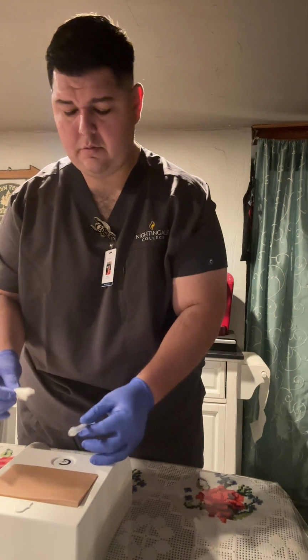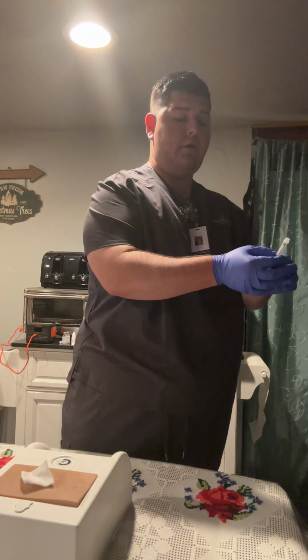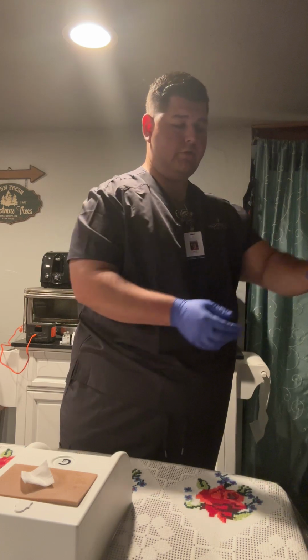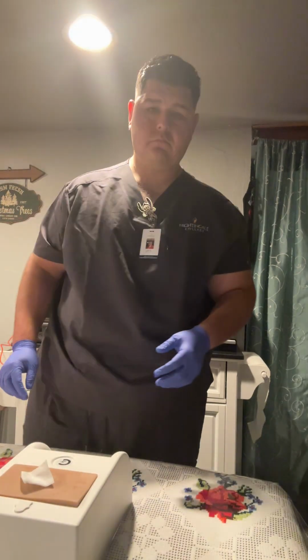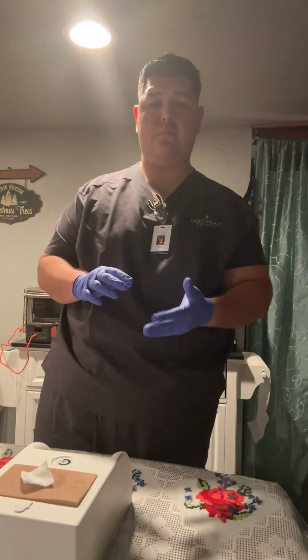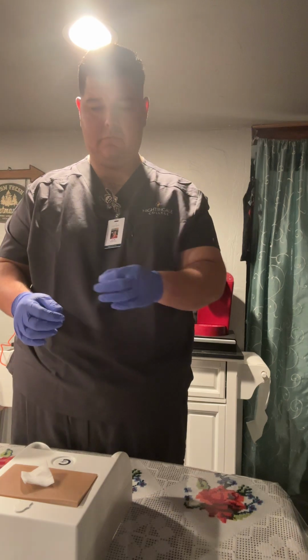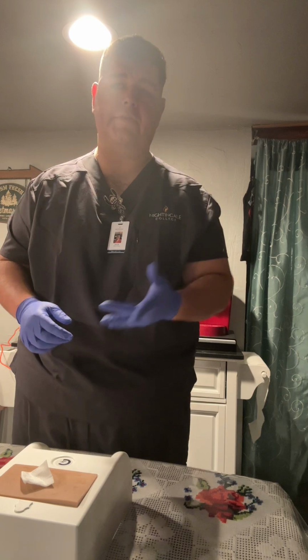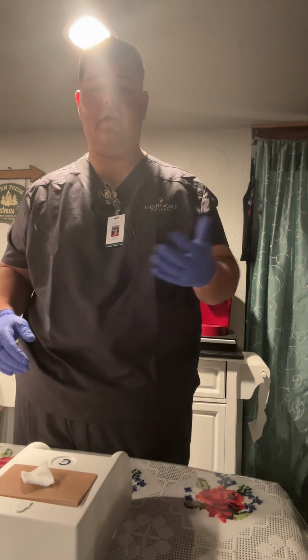Removing the needle, placing the gauze on there, disposing of my syringe. I want to cap my syringe, safety, if I can. If not, just go ahead and discard it into my sharps container. We'll discard of that. With the gauze, I want to place it on top. I don't want to press, scratch, or massage the little blob, essentially the little mosquito bite here, as it could create an irritation under the skin. I simply want to put it there gently to capture any of the blood if any is bleeding.